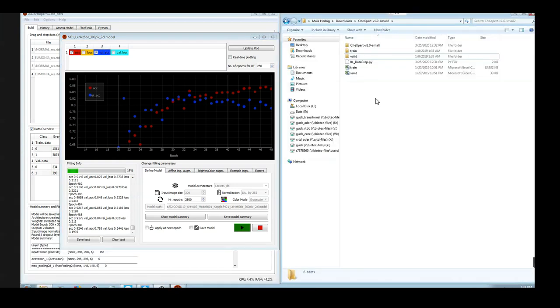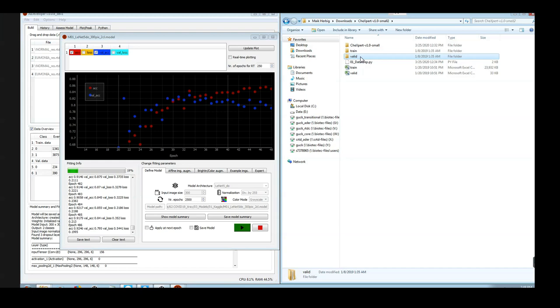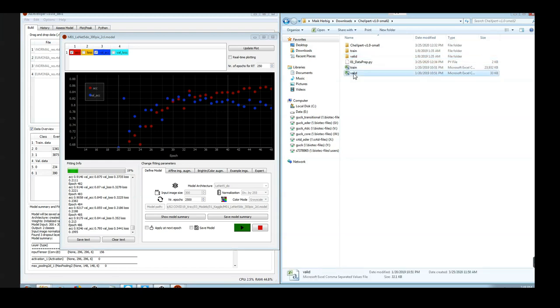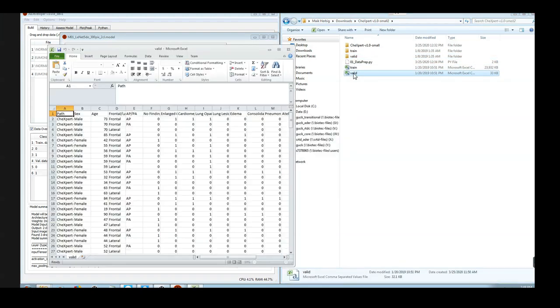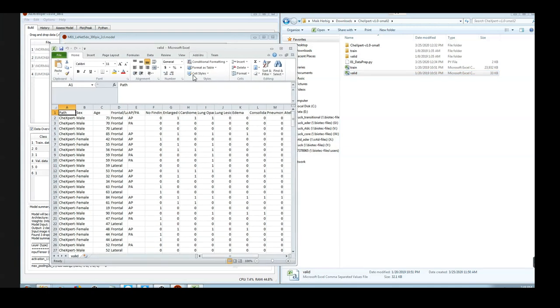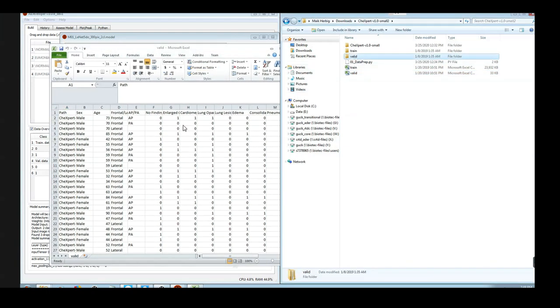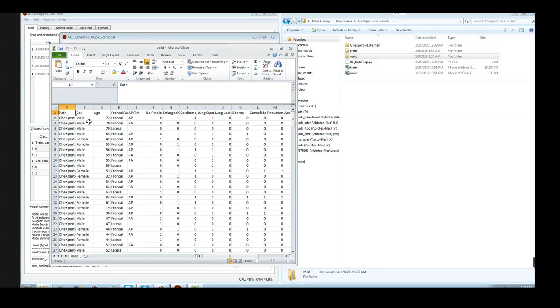When the download finished, you will find a zip file which you have to unzip. And then within this folder you will find a folder containing images for training and another folder containing images for validation. Furthermore, there are two Excel files which contain information about the individual images that are contained within these folders.